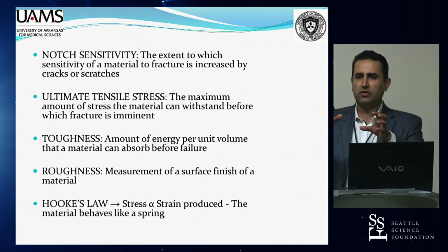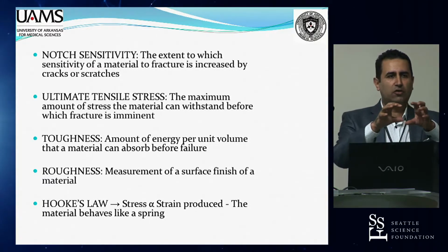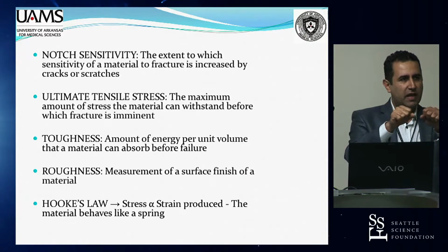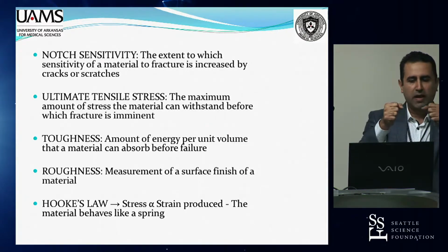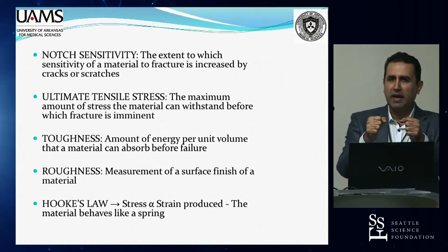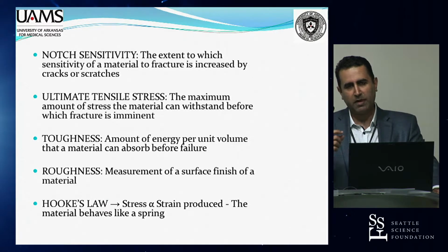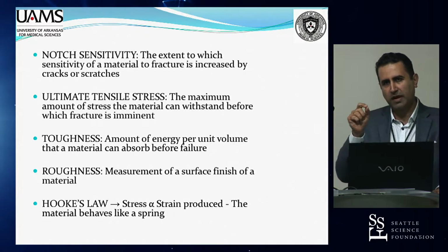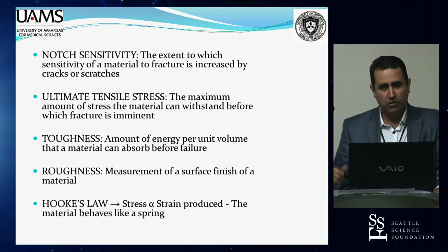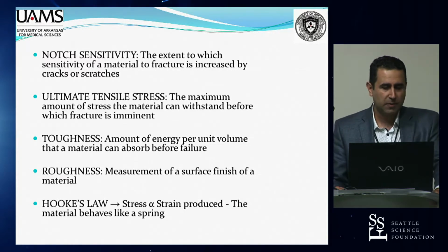Notch sensitivity, we'll talk about this, but it's the extent to which you're going to increase the ability of the material to fracture by increasing bending moment within the rod by micro cracks or scratches. And it relates to a rod. When we bend a rod, we create a notch. And that deformation at the point where the rod is bent is known as notching. We'll cover that when it comes to tips for success, but it's a major issue.